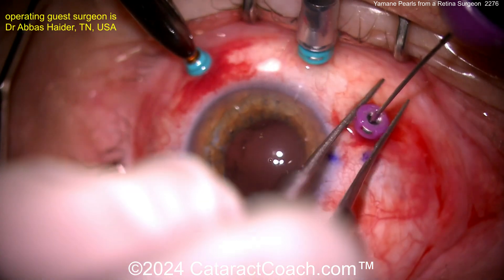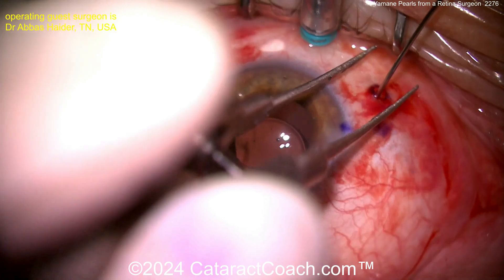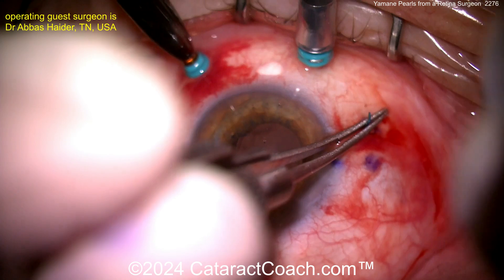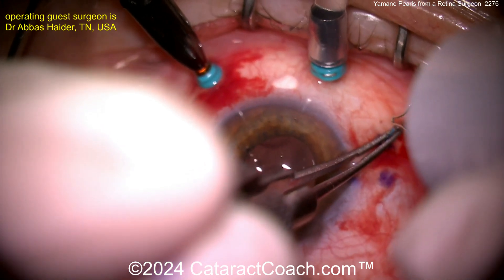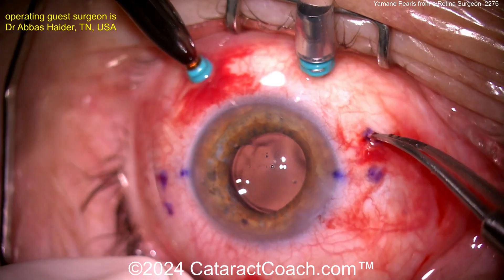On these cases, the lens tends to sit in an effective lens position similar to being in the bag. I tend to aim for a little bit of myopia on these eyes — don't aim for plano; aim for about minus one, and I think you'll be pretty happy there. Now doing the flange technique on the end, creating a flange on that haptic, and this eye is going to do great.